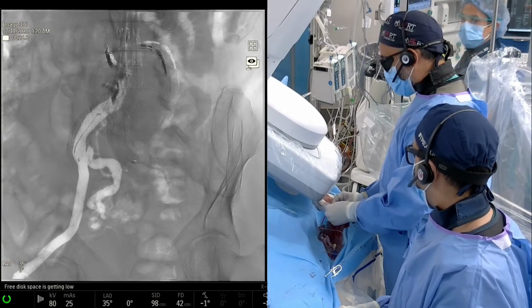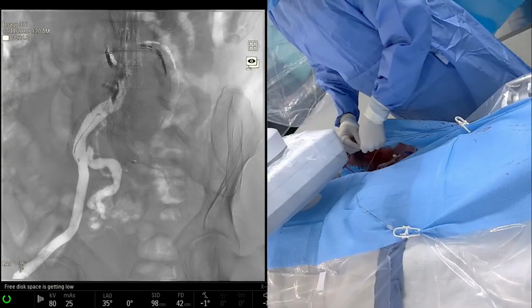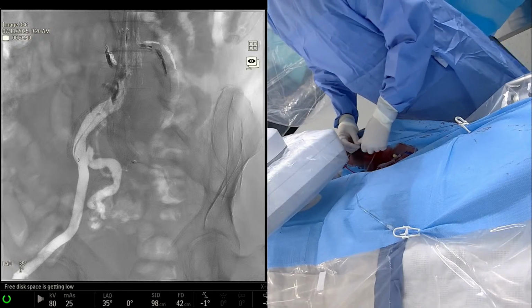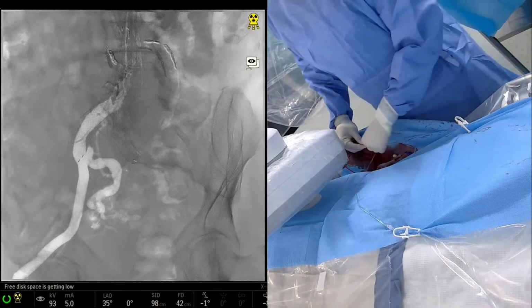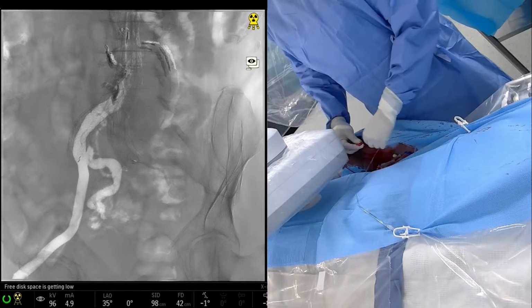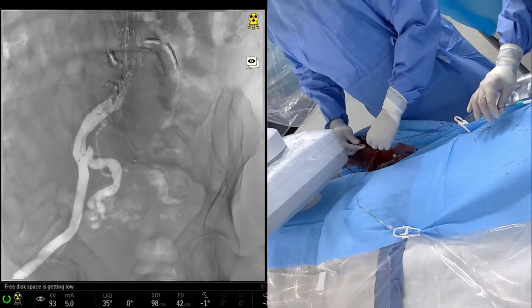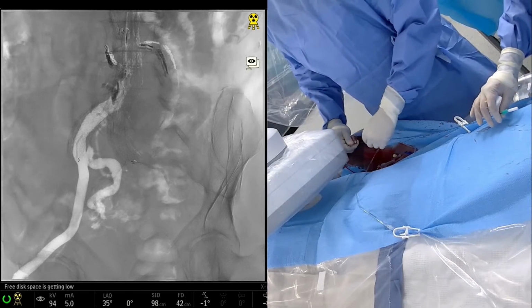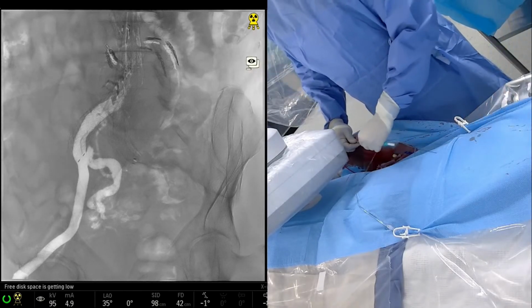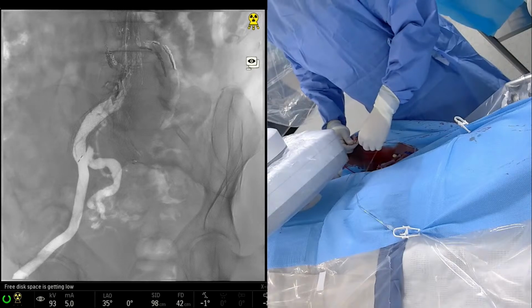But the Amplatzer 4s, we've been okay with those going from the wrist. I'm curious, have you pushed an Amplatzer AVP2 through an R2P sheath? I haven't, so that probably would be okay, right? That's what I'm thinking. Yeah.